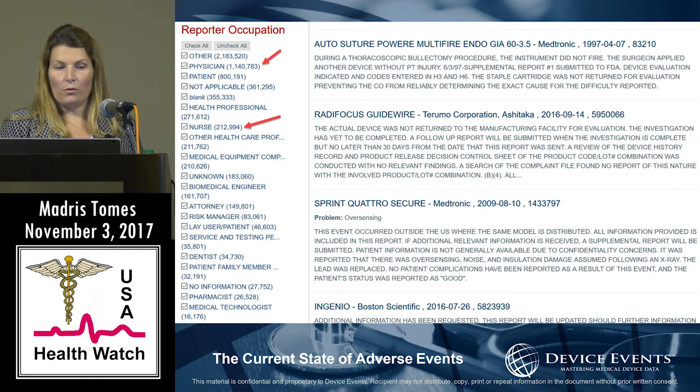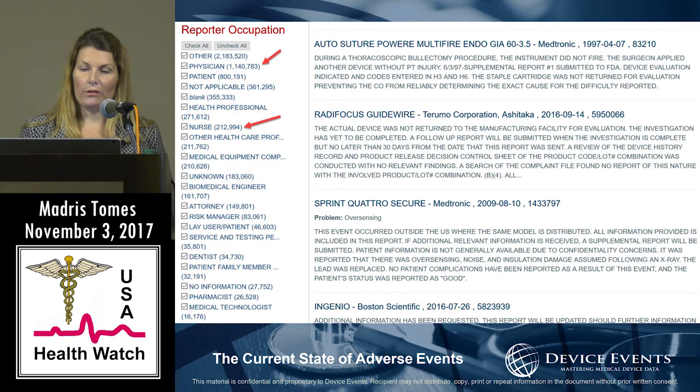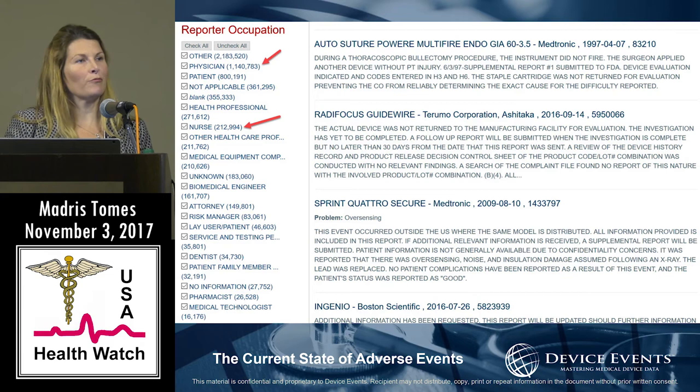One of the things I found is that a lot of physicians and nurses want to read what other physicians and nurses are reporting. So I made sure there was a way to review these by occupation. If I wanted to look at what other physicians are saying about a device, I can pull out all the physician reports and run through those. Every one of these is a report in the FDA database. Now, if it's over 10 years old, you'll see it here, but when you click on the link to see the corresponding report, the FDA page will come up blank.